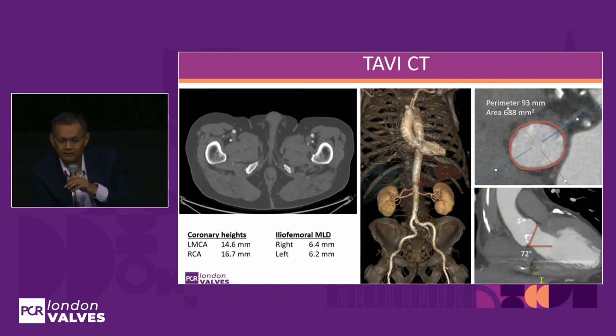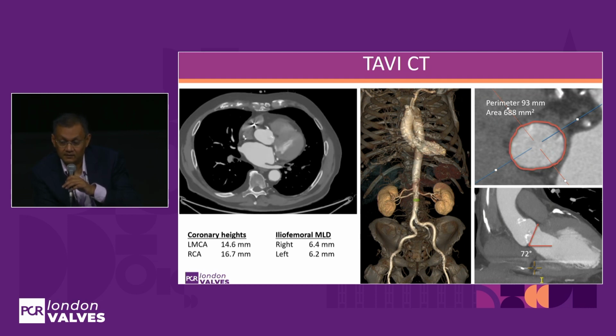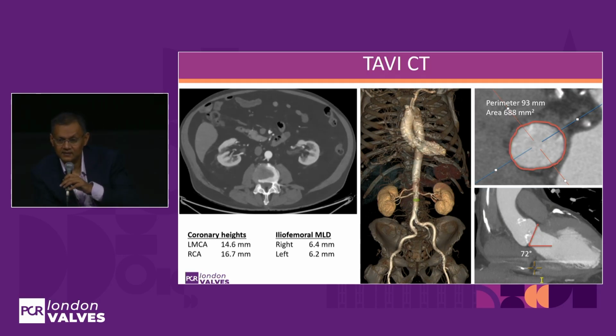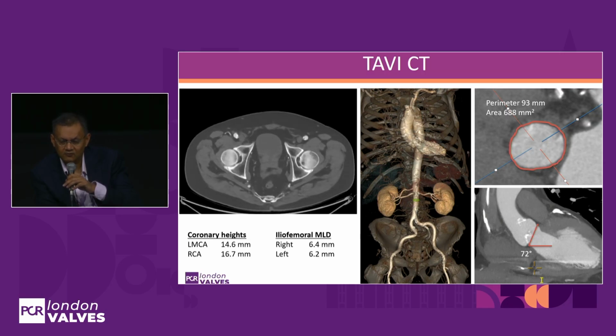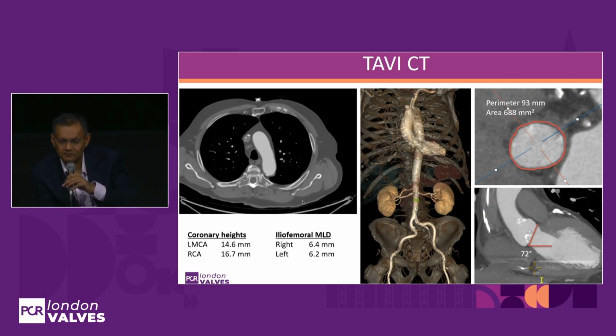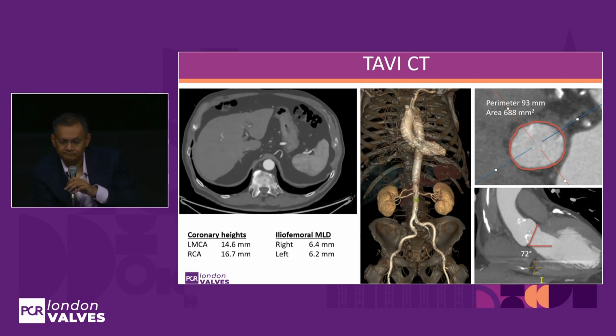With the horizontality, you want a device where you can have precise placement. We would do this either way, but we use a 35 Navitor on occasion for this. It's a larger prosthesis, but the softness of the prosthesis allows for very good and precise placement in both the non and the left coronary cusp.